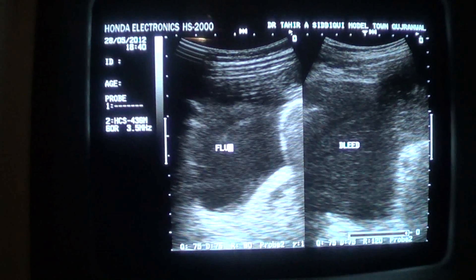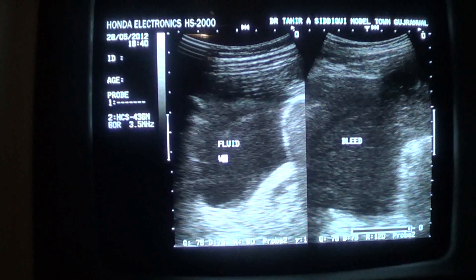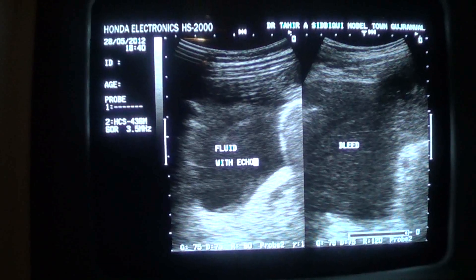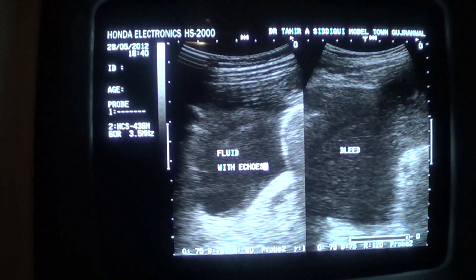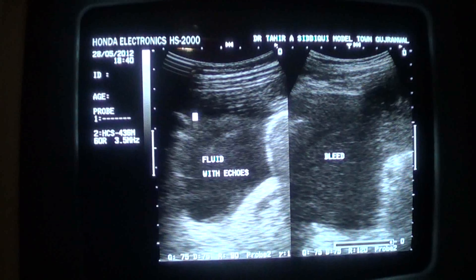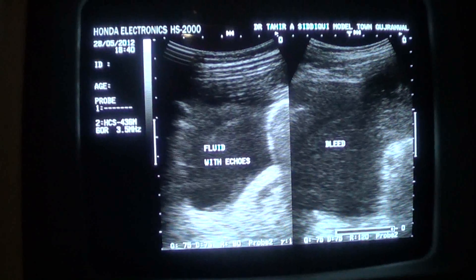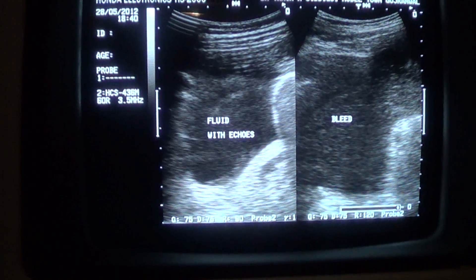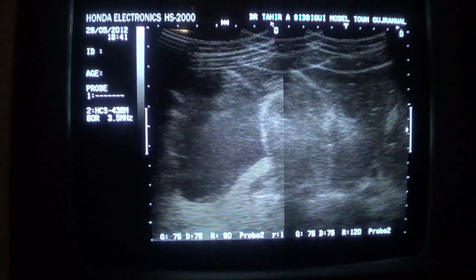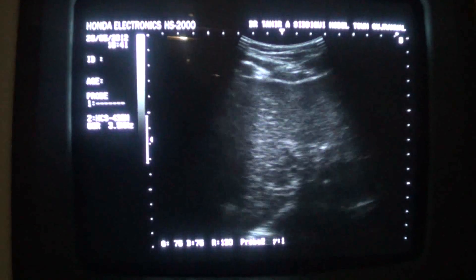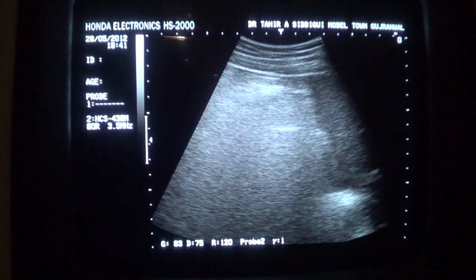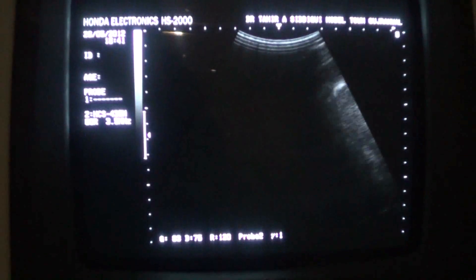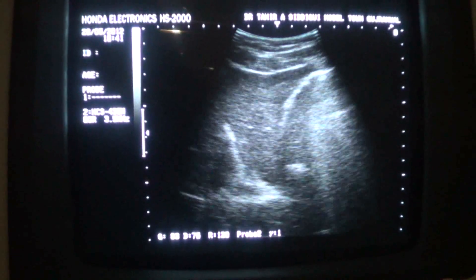This is the ligamentum venosum in longitudinal section, and this is the rest of the liver. As I move the probe 90 degrees, it will become triangular — here you are, this is the area. This is one section of the ligamentum venosum; this is the transverse section of the ligamentum venosum. There is so much fluid and the abdomen is so tense that it is becoming difficult to obtain the views.